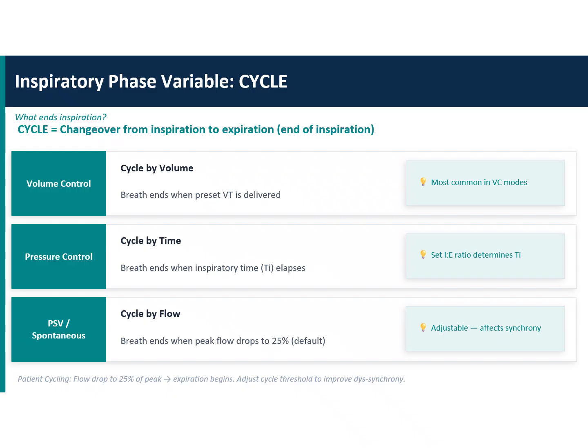That is where we switch the patient from inspiration to expiration. So among VCV, PCV, and pressure support ventilation, the cycling happens mandatorily in pressure control and volume control, and in pressure support ventilation, cycling will depend upon the peak flow rate.